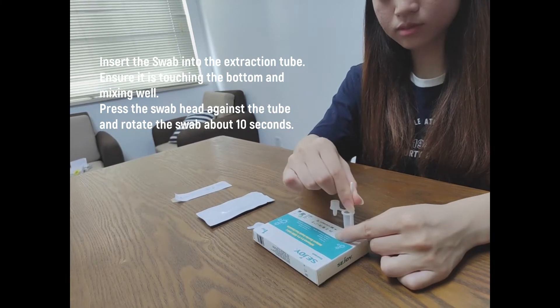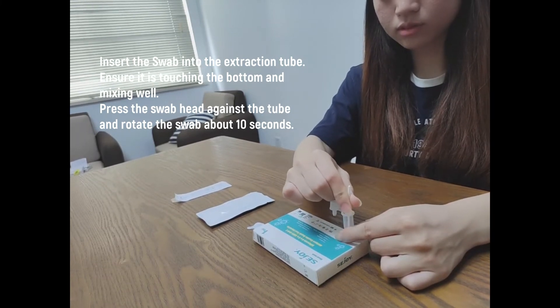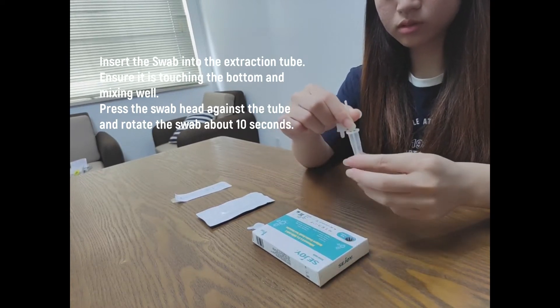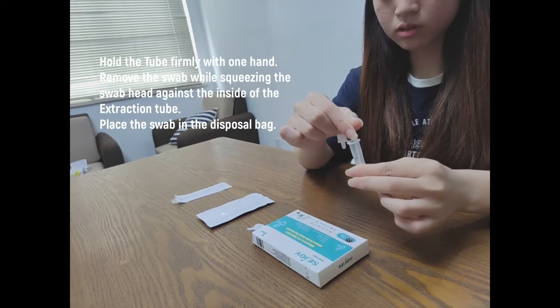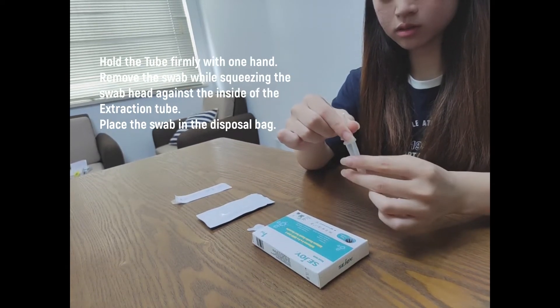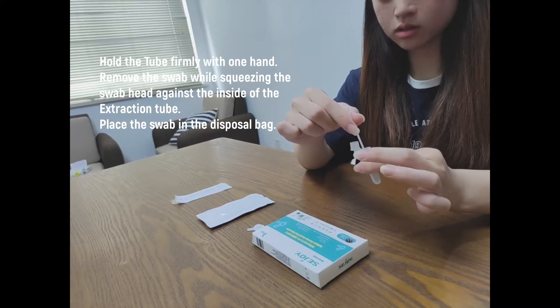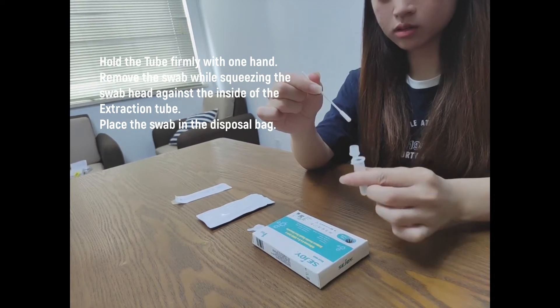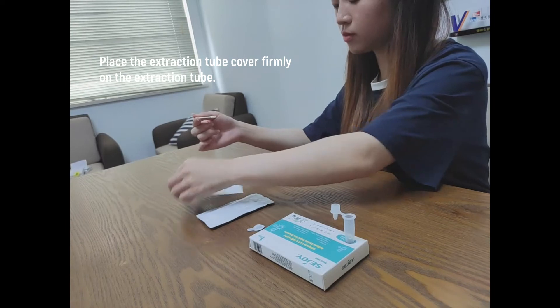Insert the swab into the extraction tube, ensuring it is touching the bottom, and stir the swab to mix well. Press the swab head against the tube and rotate the swab for about 10 seconds. Hold the tube firmly with one hand and remove the swab while squeezing the swab head against the inside of the extraction tube. Place the swab in the disposal bag, then place the extraction tube cover firmly on the extraction tube.